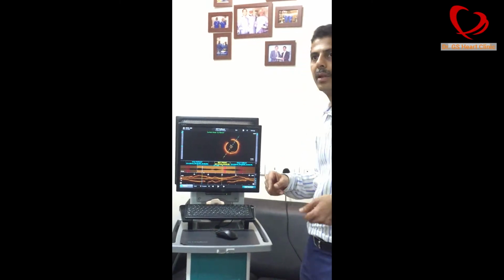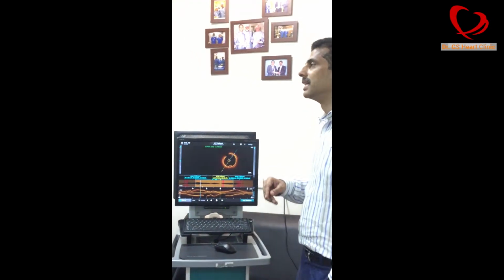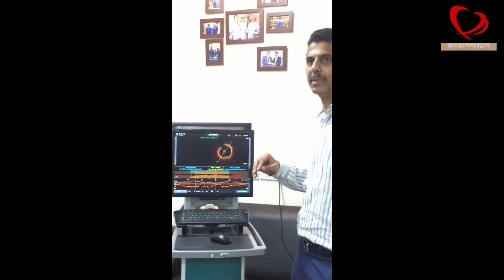What is the percentage of the angiogram not picking it up, doctor? Generally, the sensitivity and specificity is close to around 60 to 70%. That's all. It is not very high sensitivity and specificity.